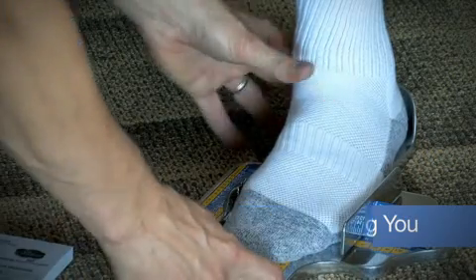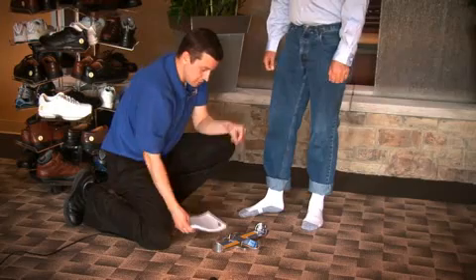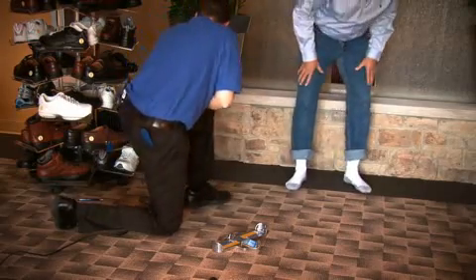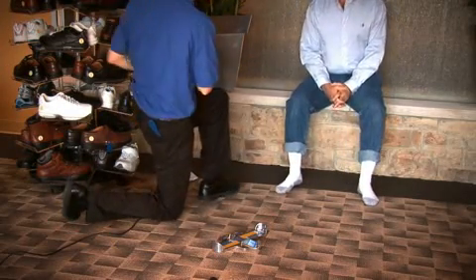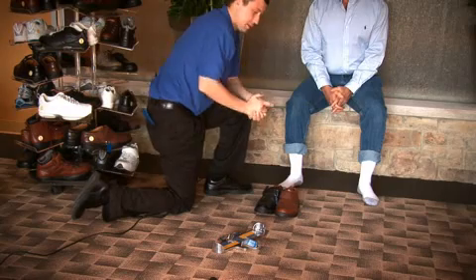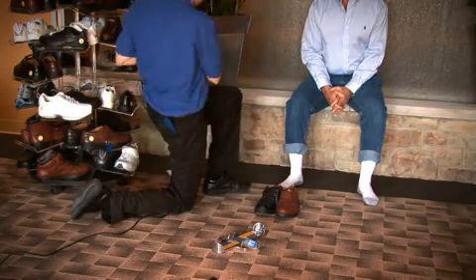From these measurements, you may lift off there, sir. We've found that this particular patient is measuring a 10 medium. So from here, I will have the gentleman sit down, and from either a display center or a travel display center, you will grab a 10, in this case a wide, off of the shelf. Now, we know that a 10 wide is probably going to be too wide for this gentleman. However, our display center has wides in all sizes.